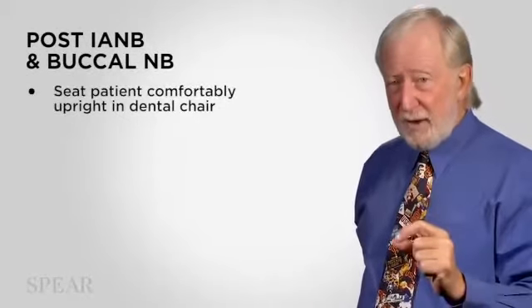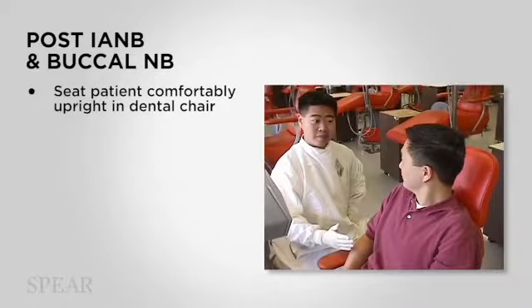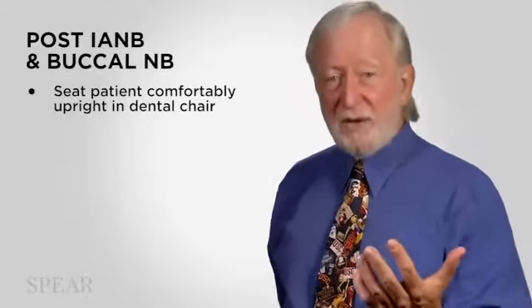All right, so once these 2 injections have been completed, what you should now do is seat the patient upright, comfortably upright. Now, there's an implication here. By saying you seat the patient upright after the injection is completed, I'm implying that your patient is lying down for the injection. And to me, that's very important. One of the subjects I also teach is medical emergencies. And the most common medical emergency seen in dentistry is fainting.